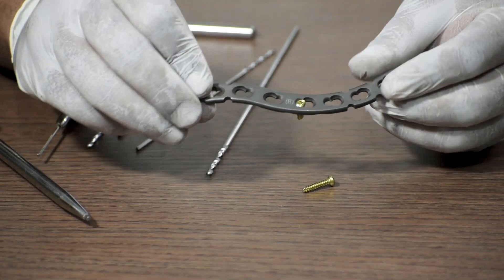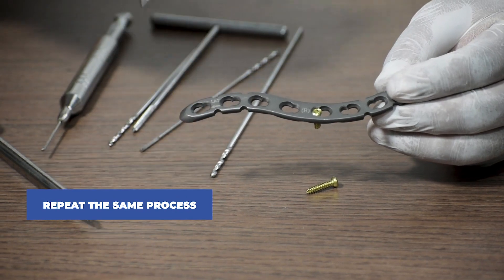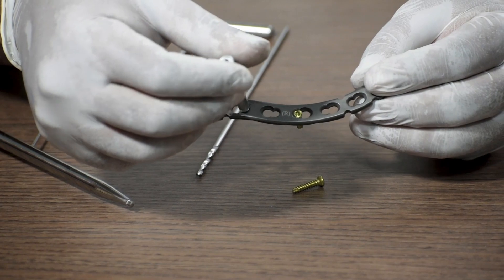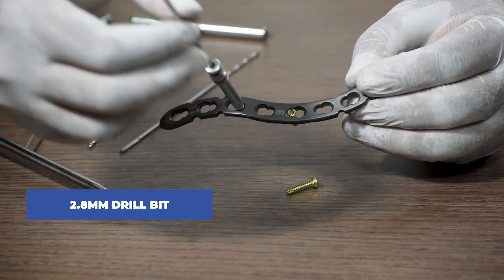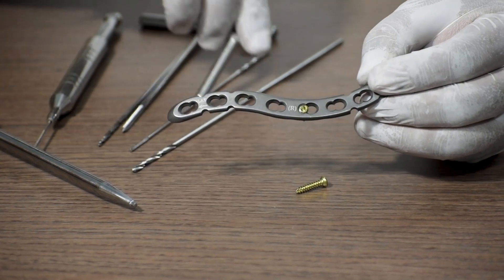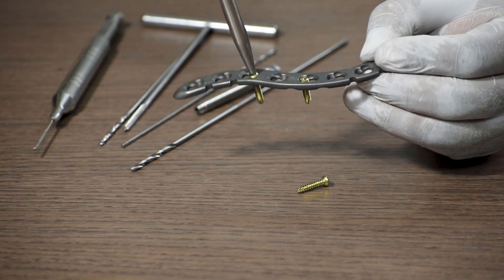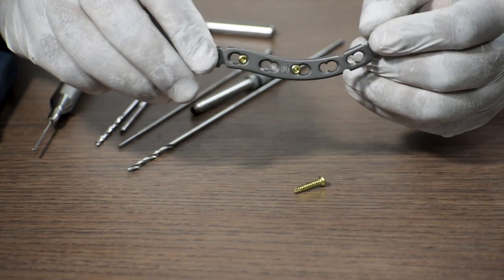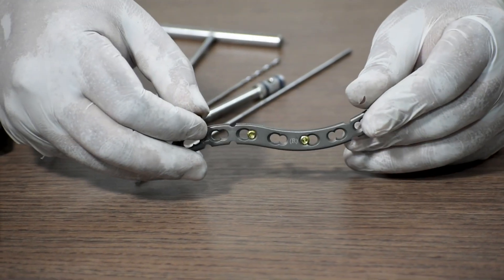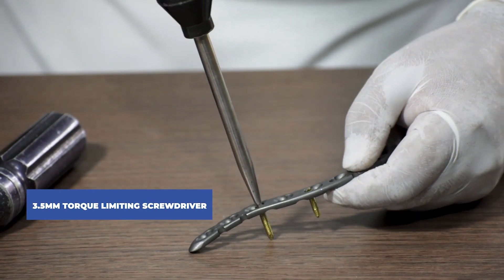Thereafter, as per the surgeon's requirement, we keep repeating the same process and fix as many screws as needed — this call is made by the surgeon. For each additional locking screw, the 3.5 mm drill sleeve is attached in the locking hole, a 2.8 mm drill bit is used to drill through, depth gauge is used, and the screw is fixed with the solid screwdriver. Lastly, we use a 3.5 mm torque limiting screwdriver to check the torque of the locking screws.